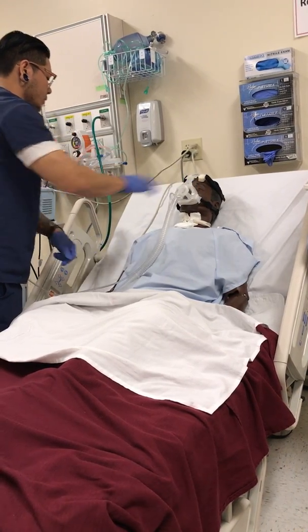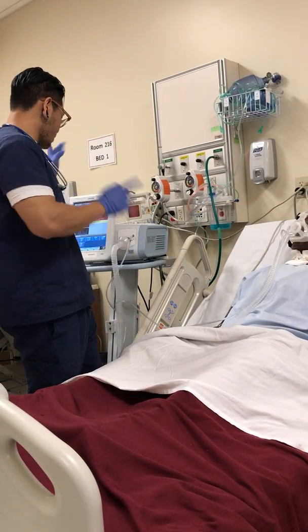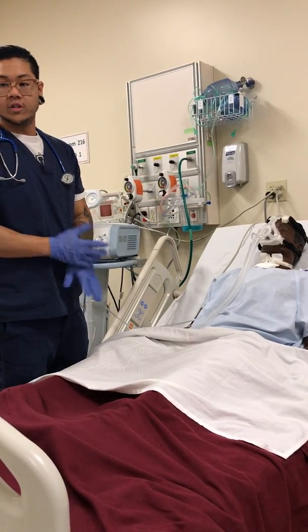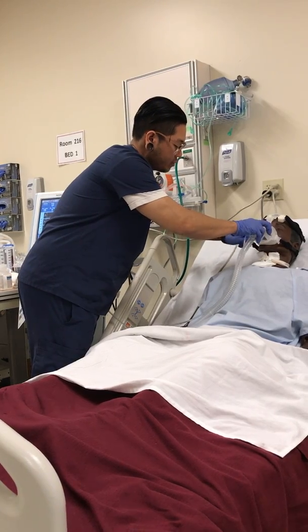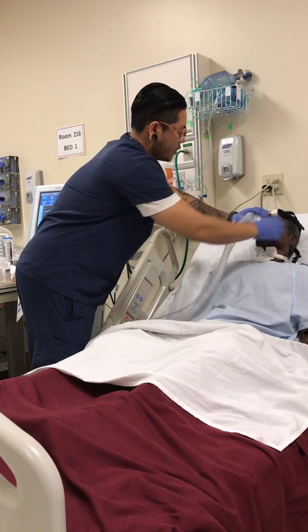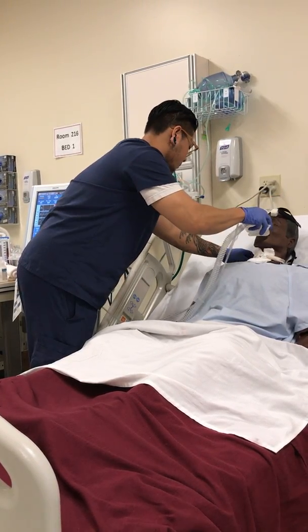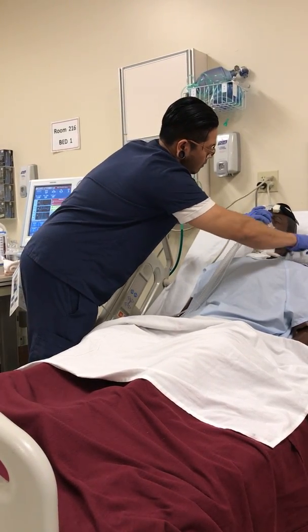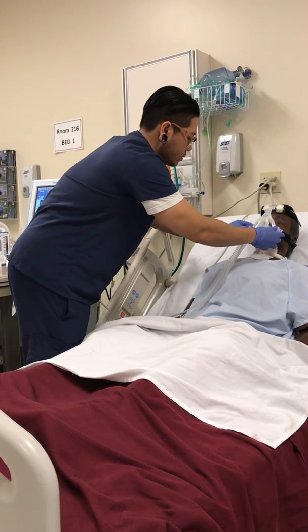Alright. And at this point, you also want to let the patient know that if they feel like throwing up or they feel uncomfortable, or something is wrong, they can always take it off by unclipping the hinge. You can click one, move it up a little bit, or you can click both if you need to throw up, and just lift up. Alright, so there we go.